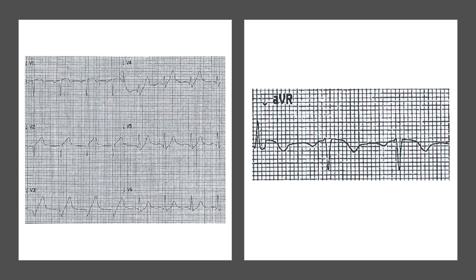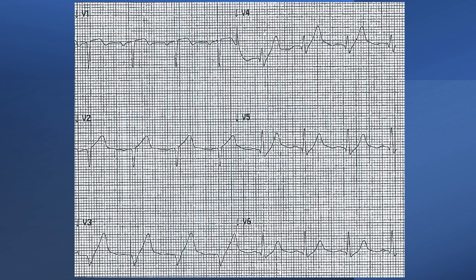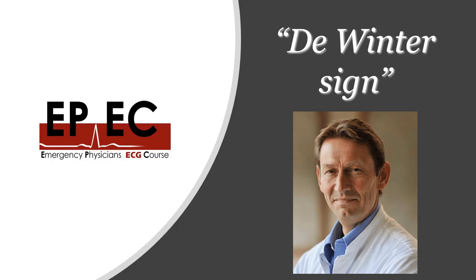Looking more closely at AVR, we can clearly see ST elevation. In the anterior leads, we also have poor R wave progression, which is another sign of ischemia. Then we see the ST depression that is upsloping, followed by a tall symmetrical T wave. That odd-looking upsloping ST segment followed by a tall symmetrical T wave is what is called the De Winter sign.